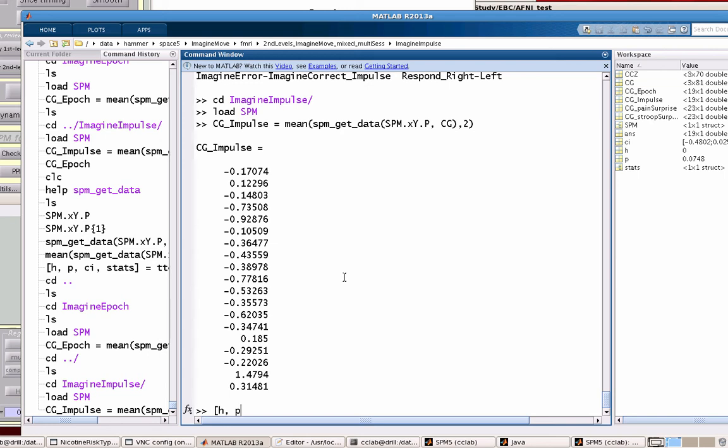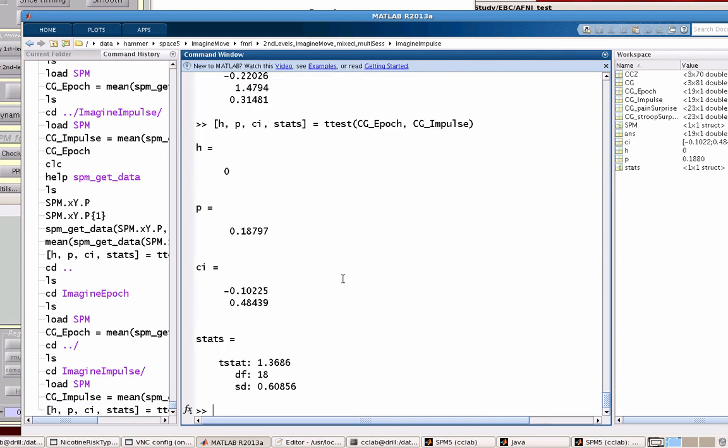Using built-in MATLAB functions. So H, P, CI, stats - this is just because it's a function which returns all that stuff - t-test CG_epoch, CG_impulse. So are these two significantly different from each other? Well this would suggest no.